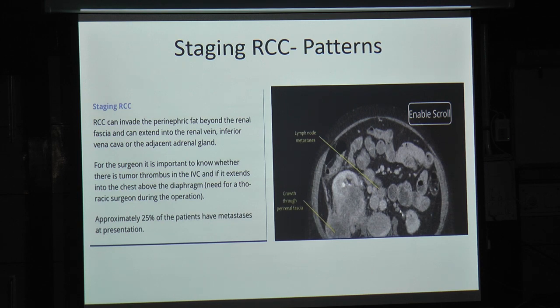They are more built into the radiology program than in urology, but really look at the homogeneity, number one, and shape, ball or a bean. It helps you most of the time. Extension of the tumor: is it going to the UPJ, to the ureter? Where is it arising from? Where is the center of the tumor? Is it in the collecting system or parenchyma? These are the 4 clues that you really run through your head before you make a diagnosis.